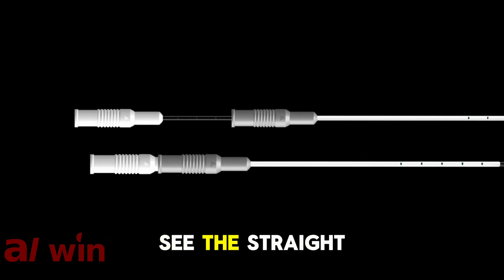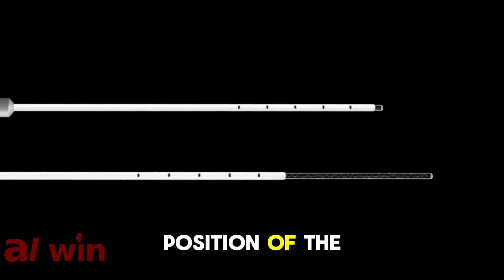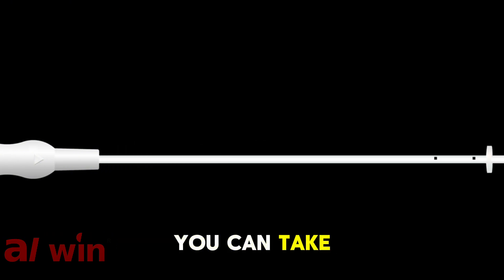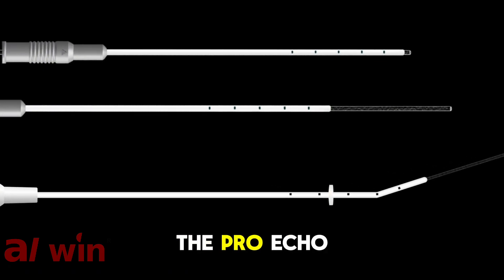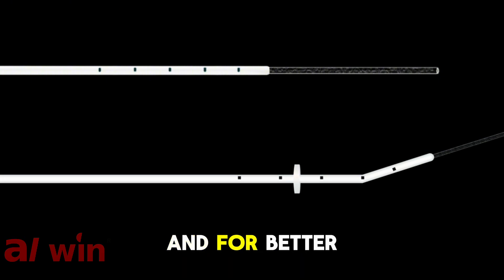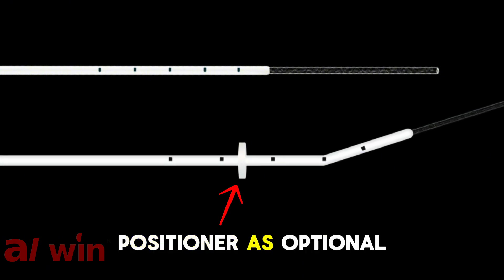Here we can see the straight sheath of the Ecotrans embryo transfer catheter. But if the position of the uterus is in retroverse or the cervix isn't straight enough, you can take advantage of the elbow that the Pro-Ecotrans sheath has. The sheath of the Ecotrans and the Pro-Ecotrans has a marked area so the doctor can see how far inside he is going. For better accuracy, the Pro-Ecotrans sheath also has a silicone depth positioner.